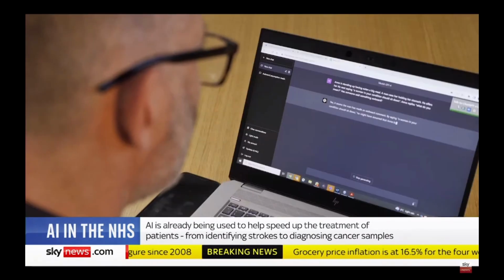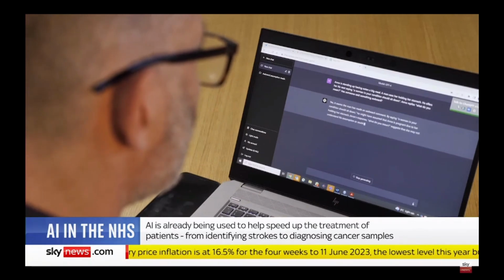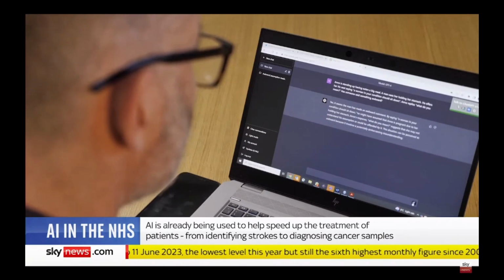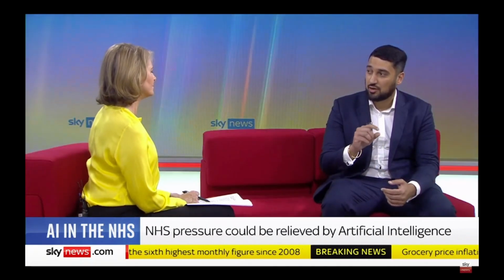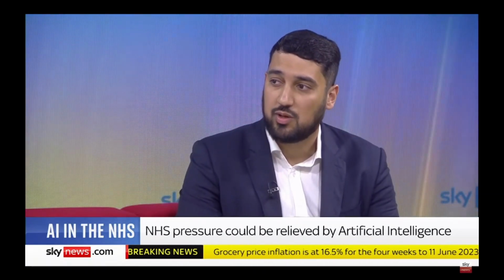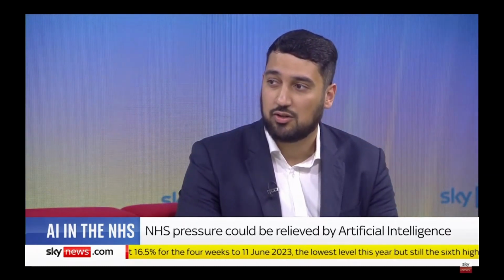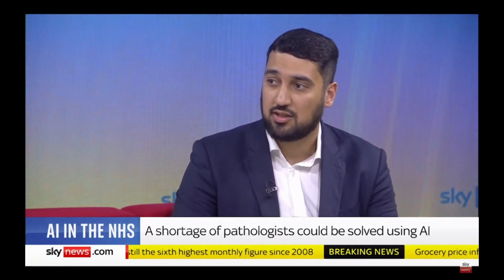You can now have that image analysed by an algorithm for either primary or secondary read. So primary read, it will assist the pathologist in being able to provide the diagnosis by highlighting key areas that build up the characteristics of a cancer data set. And so rather than the pathologist having to actually identify on the slide where these characteristics are, the algorithm will display them directly. The second way is through a second read, so quality assurance to mitigate misdiagnosis. As every single cancer is diagnosed, you can have the algorithms working in the background to quality check and assist the doctor and provide an audit of cases that have already been reported.